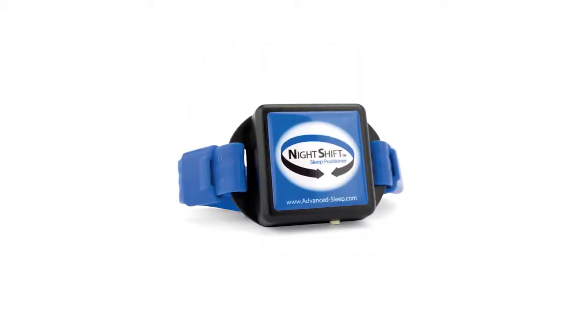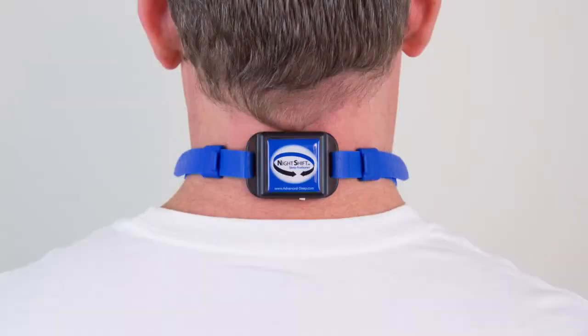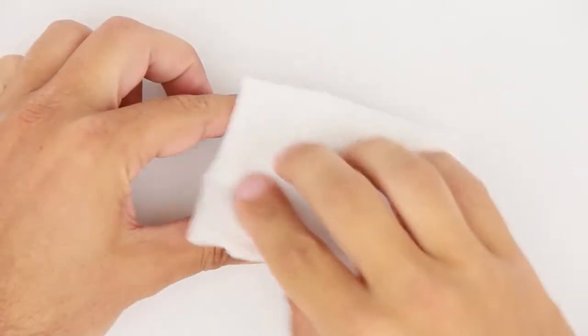The Night Shift instructional video will explain how to properly fit, operate, and clean your Night Shift.